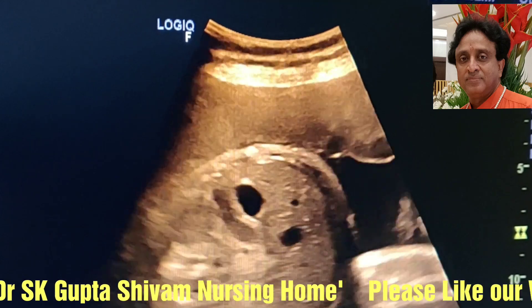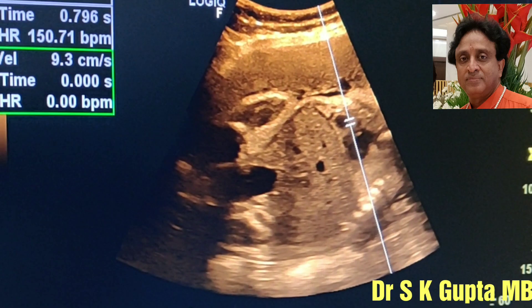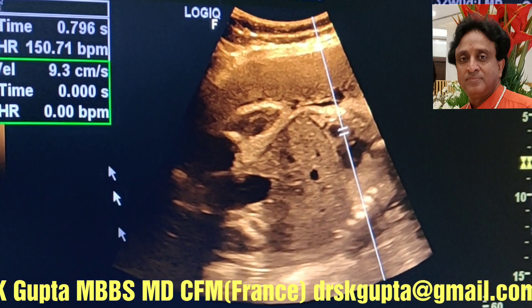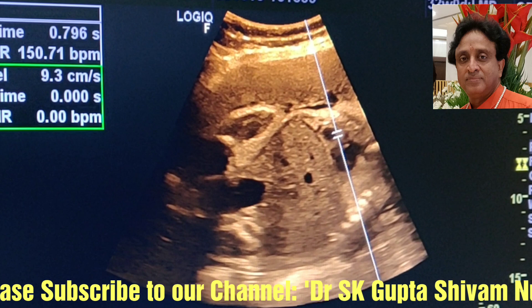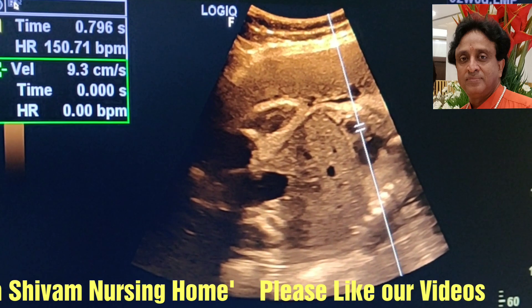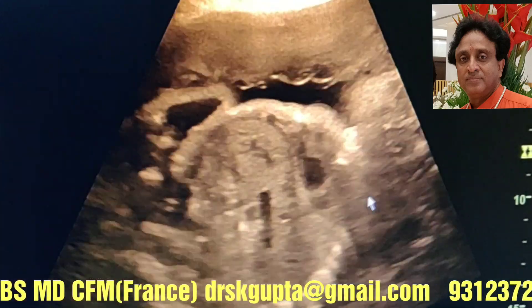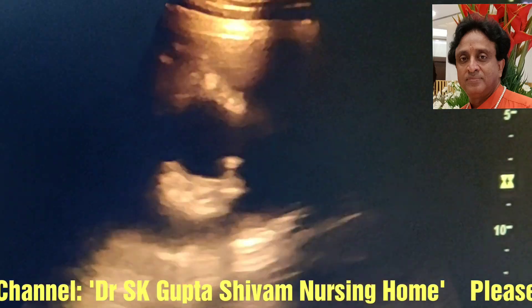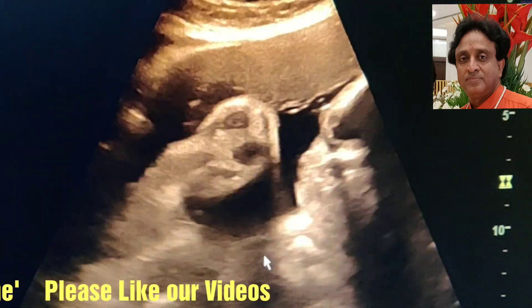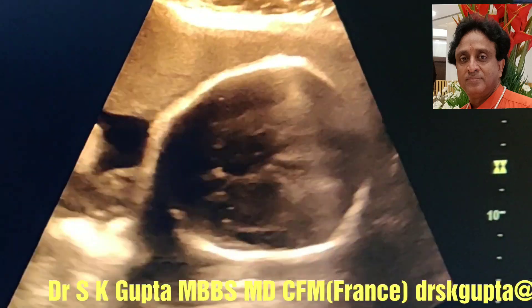One should try to see fetal movements. Here we have tried to record the fetal heart rate again and we see it is 150 beats per minute. If the fetal heart rate is not increasing and the baby is still, we can try dipping the probe into the abdomen. Using dipping movements, fetal movements are very well seen here — all four limbs are moving spontaneously. There is no confusion in this patient that the Manning score is good and the baby is in good condition.